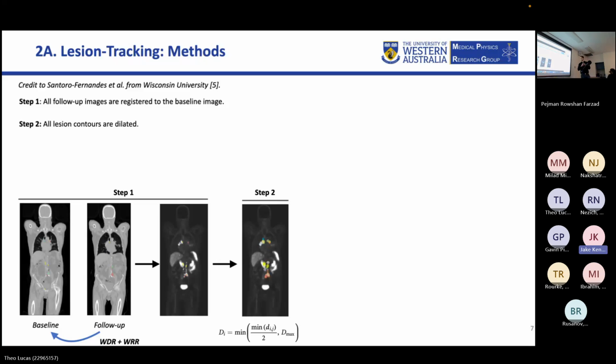And this was done in 2 ways. By applying this formula, which is really small on the screen, this is called an automatic dilation. It's going to look at every lesion and assign a dilation-specific radius to every lesion. Also experimented with was applying a fixed dilation radius. So for example, increasing every lesion by 3 millimeters, let's say, morphologically in every direction as well.